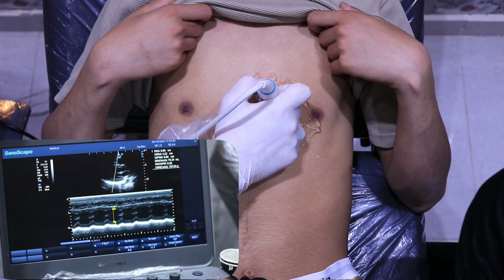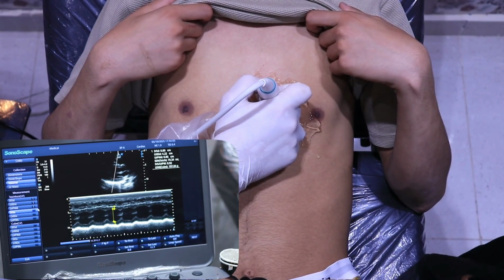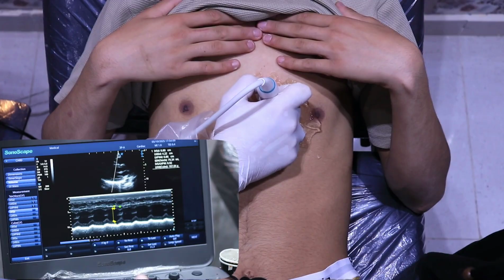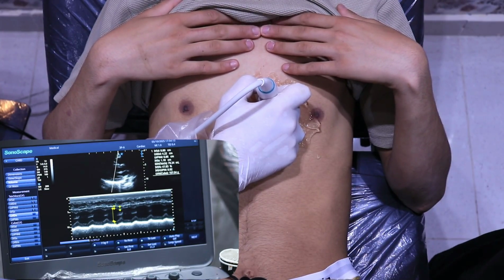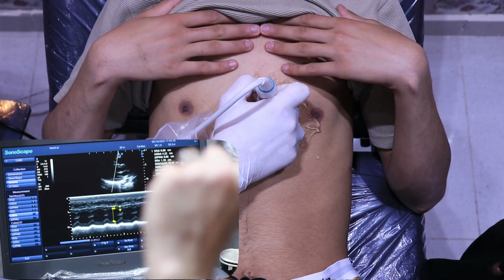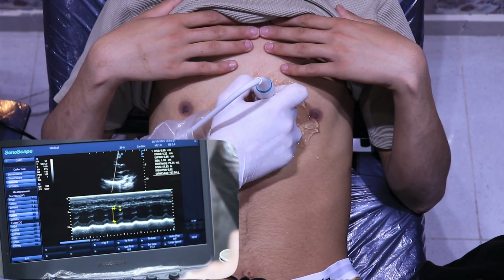طيب نرجع بقى تاني للmeasurements. Now we'll go for the systole. The IVS during systole. So we'll go here. Okay, let's take it from here. شايفين الكرسر فين يا جماعة؟ Till here, okay? During systole, there's actually a difference between diastole and systole. So that means there's actually thickening of the heart during systole, and this is the strain. يعني في difference between systole and diastole.